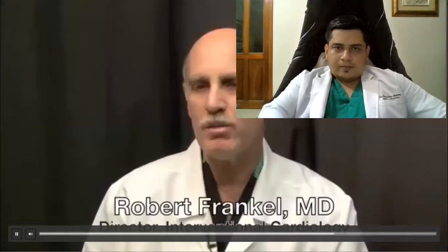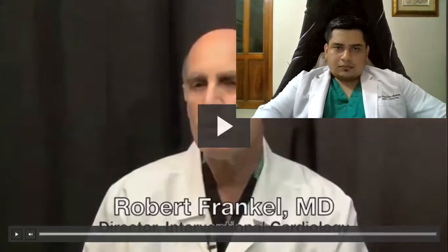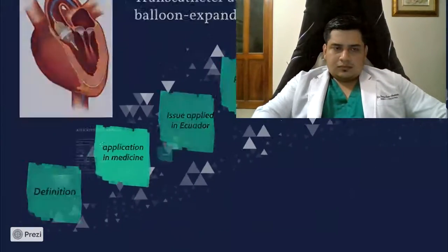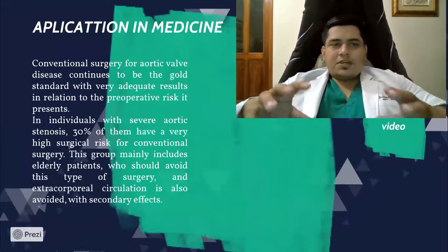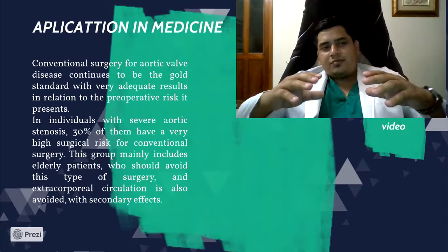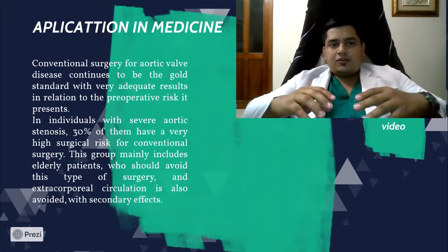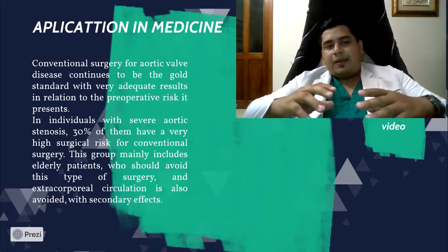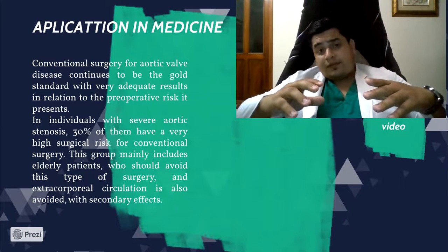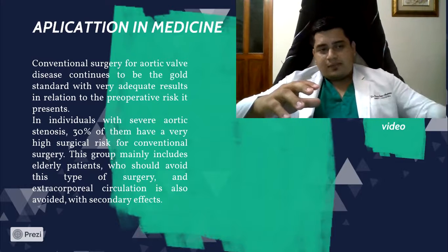The TAVR procedure, the transcatheter aortic valve replacement, is revolutionary. In the application in medicine, conventional surgery for aortic valve disease continues to be the gold standard, with very adequate results in relation to the preoperative risk present.